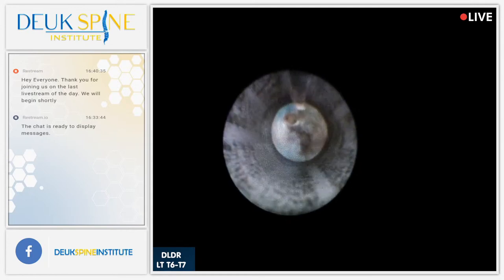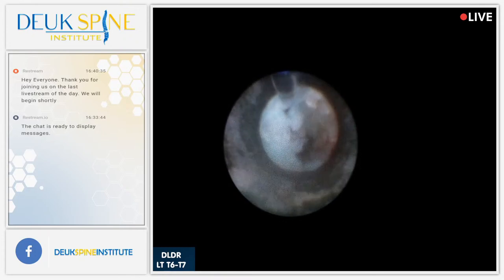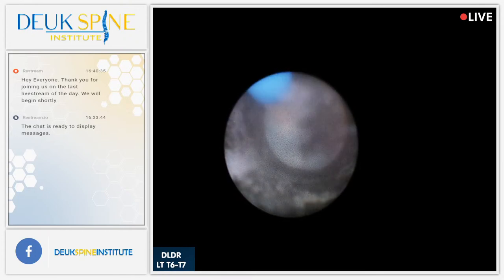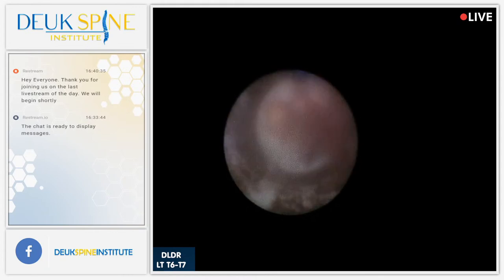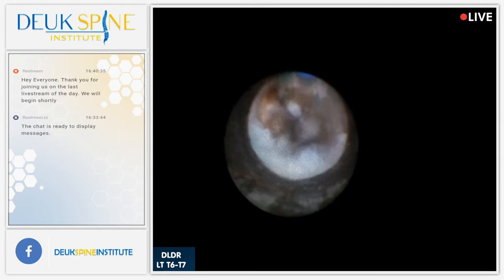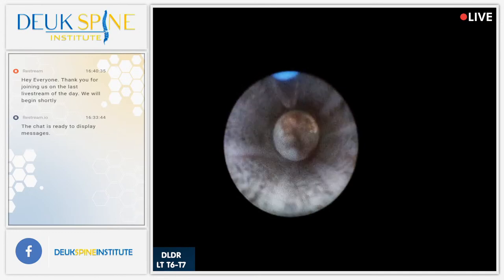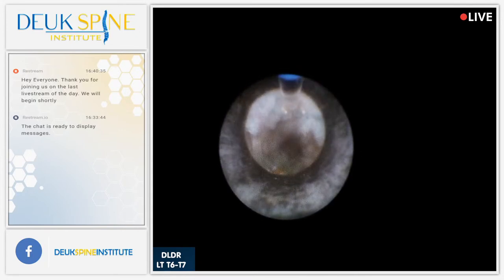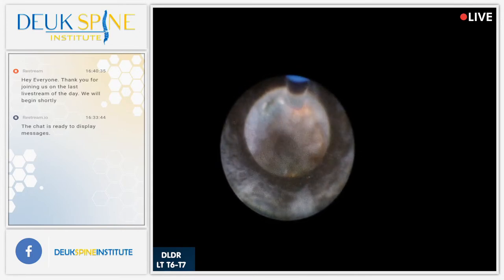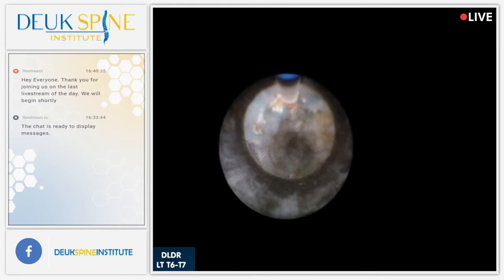Just about done. Do you want me to spike another bag? No, we're done, I think. Unless the bag is empty right now. Then there's something wrong with the machine. Then you've got the wrong machine cranked up. Whatever's cranked up is not the irrigation pressure machine.